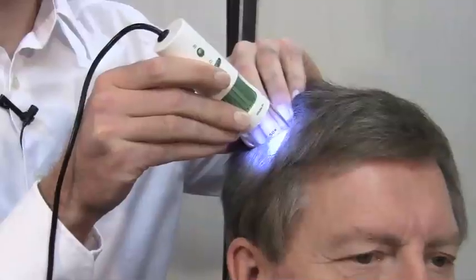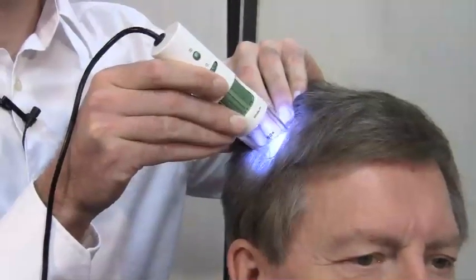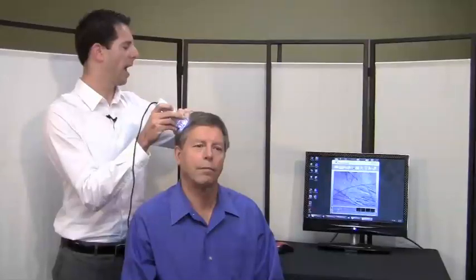Once you have got an image that you approve of and that looks good for examining density, you touch the capture button on the D-Lite microscope. And now that image is saved on the computer for comparison.